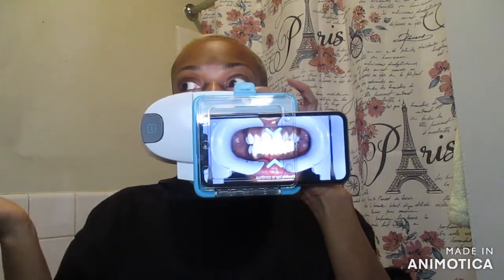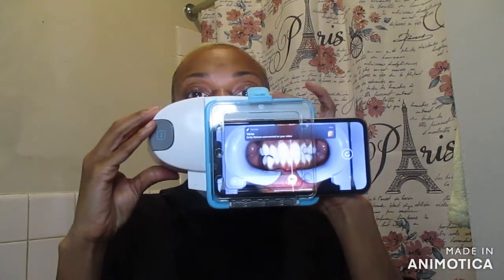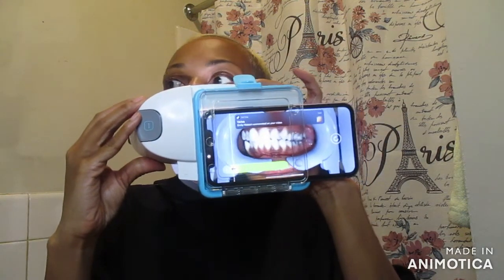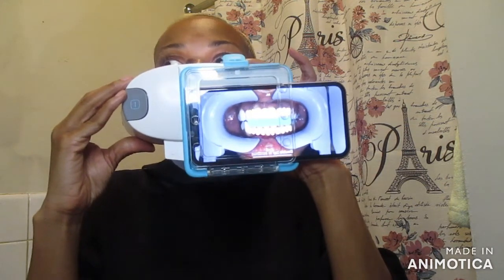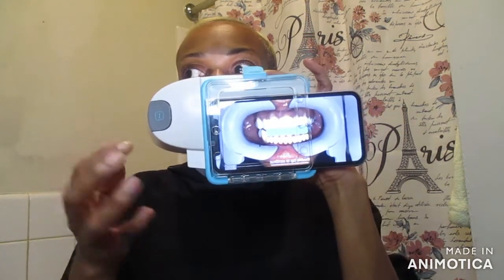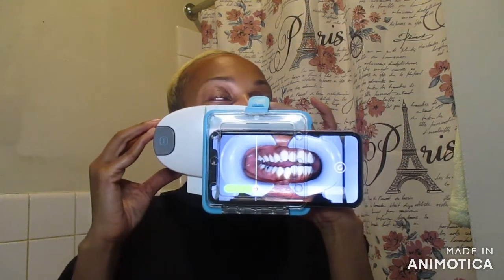For this step, bite down on your back teeth and keep your teeth together. Double tap to continue. Bite down. Shift the scan box to one side. Now shift the scan box to the other side. Back to the center. For this next step, you'll have to keep your teeth slightly apart and scan side to side. Double tap to continue. Open your mouth slightly and keep your teeth apart. Shift the scan box to one side. Now shift the scan box to the other side. Back to the center.